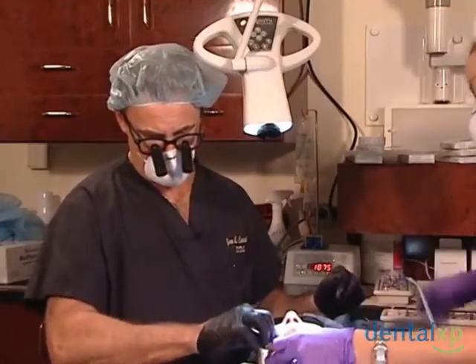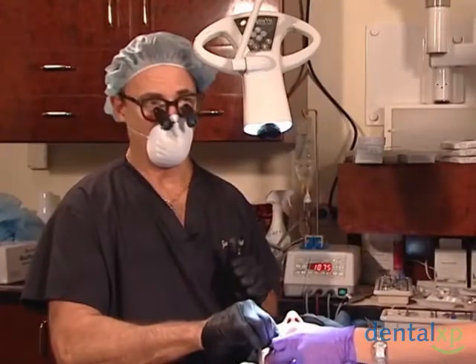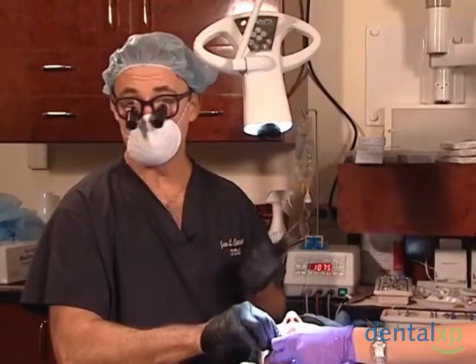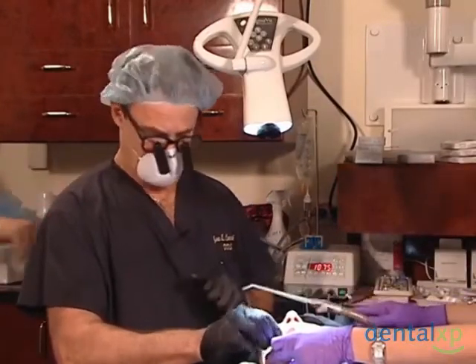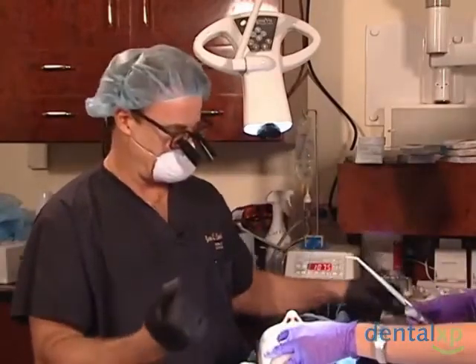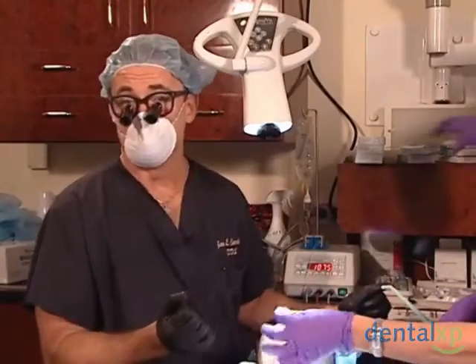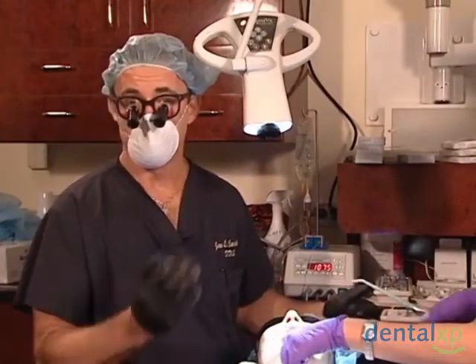But sometimes you'll get in this area and it will bleed quite profusely to a point that you think you've done something wrong. How do you stop that from bleeding? You either place the implant or place a paralleling guide and it will stop. Also, when you're reflecting a flap, it may bleed quite profusely. Once you get the periosteum pushed away, it stops. So remember, you want to get to that point as quick as you can.